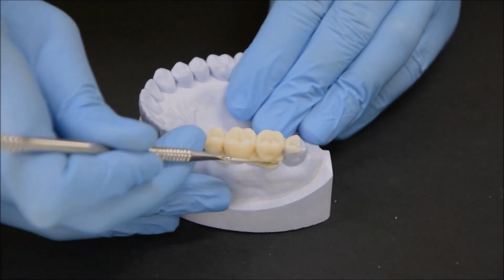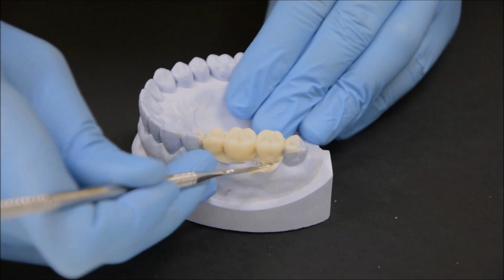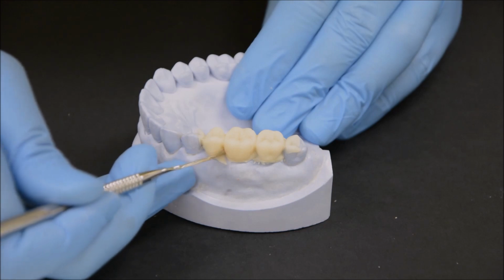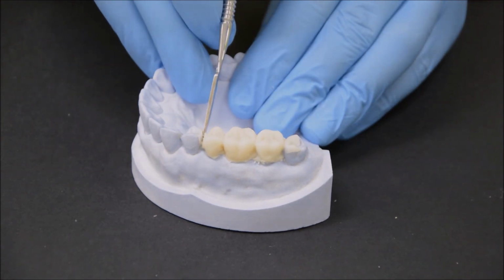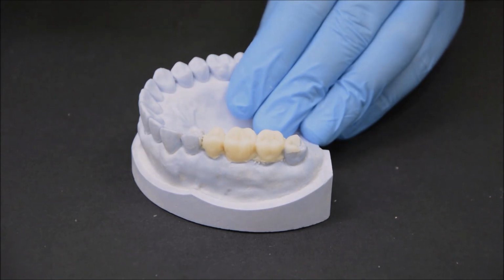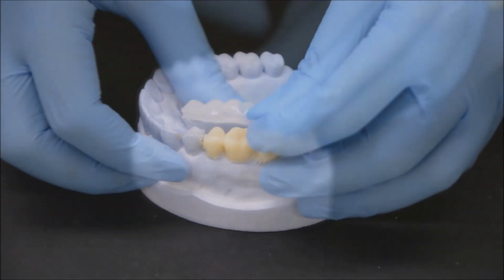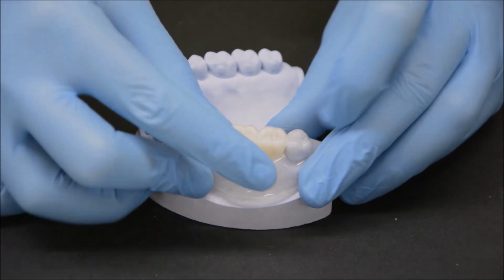The excess is cut away carefully. Note that you should remove material from the gingival embrasure area as well as the material that has flowed over the occlusal surfaces of the adjacent teeth. This will provide less chances of increasing the vertical height of the provisional, leading to the need of extensive occlusal adjustments intraorally. The thermoplastic mold is placed over the acrylic again and adapted to ensure proper adaptation of the material onto the cast, which may have pulled away while removing the excess.